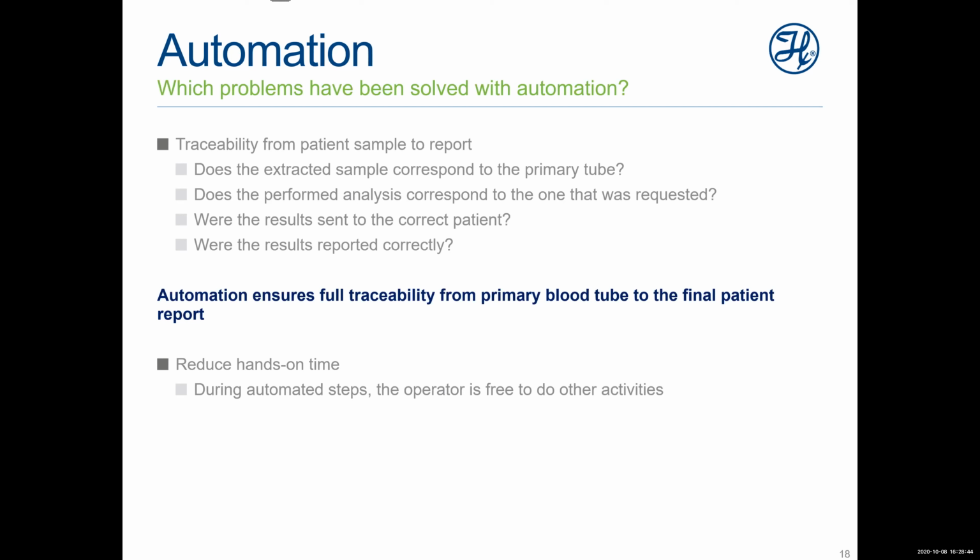So if one patient doesn't need one analysis, we have a check that can tell us that, and so we can notice that and avoid this kind of error.